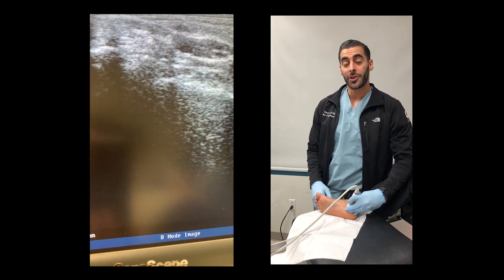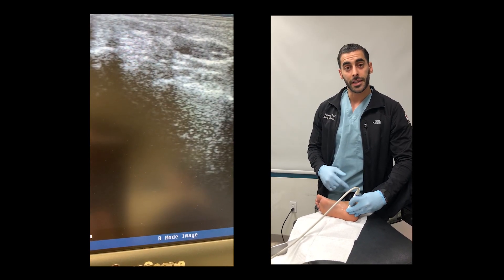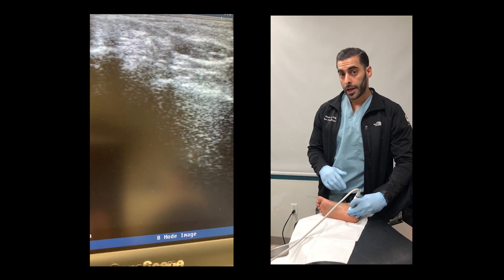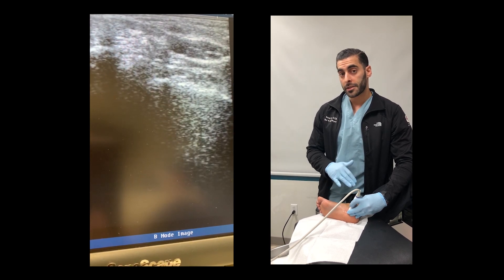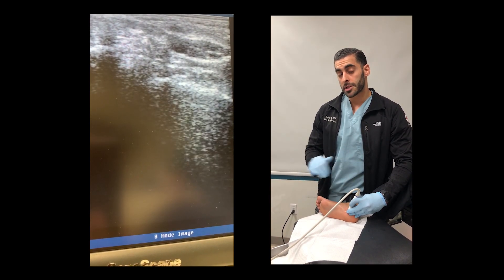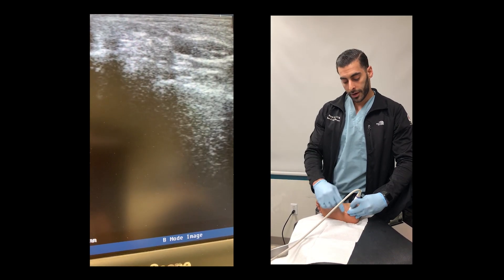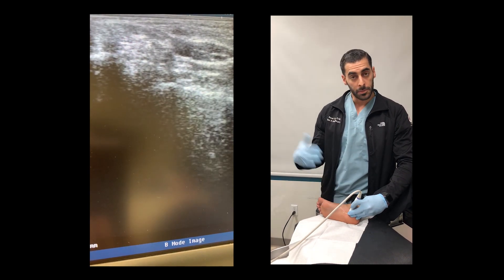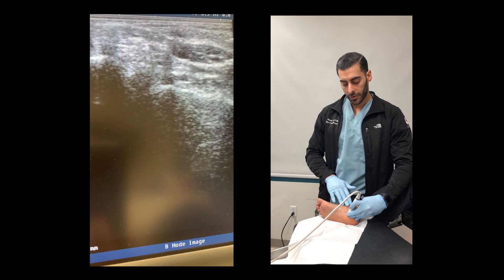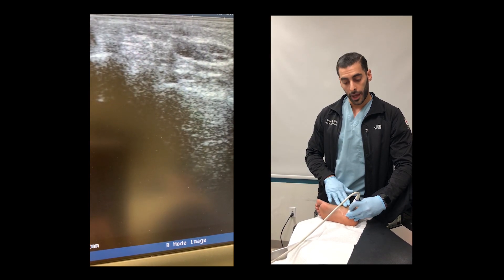Now I'm going to show you guys how you can use an ultrasound to identify the structures of the medial compartment of the ankle as well as identify the posterior tibial tendon and trace it all the way down to its insertion. Right here I have the patient with their hip externally rotated and have good exposure of the medial side of the ankle.